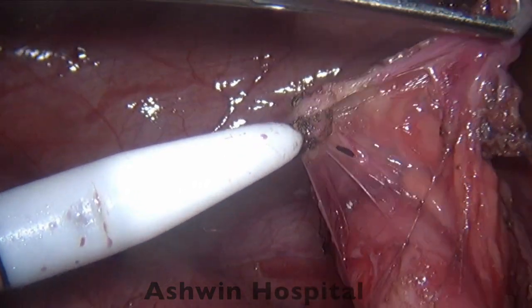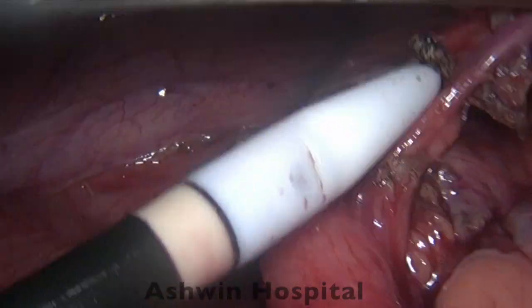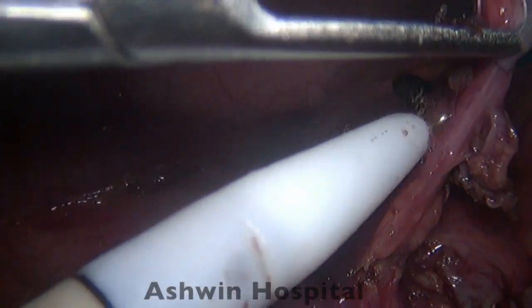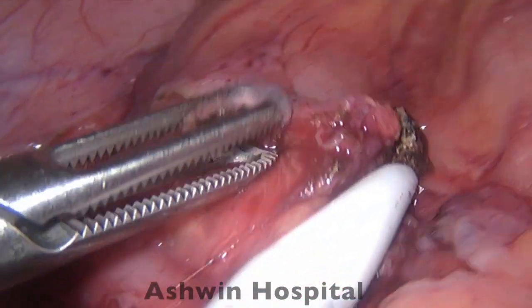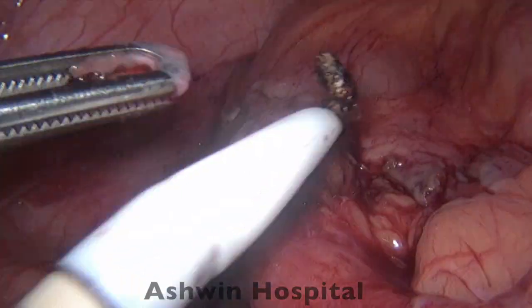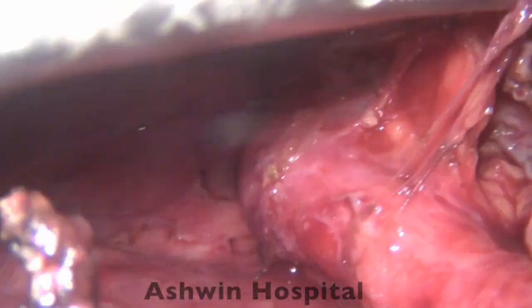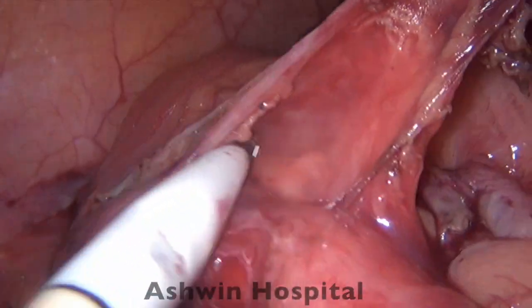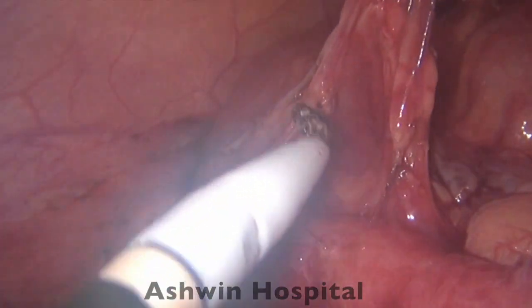Immediately upon releasing the attachments, the appendix becomes bare — similar to the familiar structure — but we do not have this good vision in the initial phases of dissection. Only after exposing it well are we able to identify and appreciate the structures. We hold the thin attachments and dissect between them and the appendix, trying to open up a window where only the meso-appendix and appendix are left.